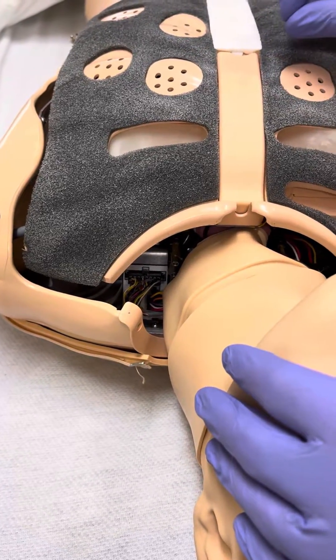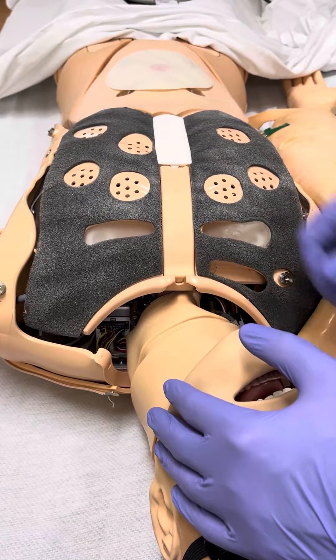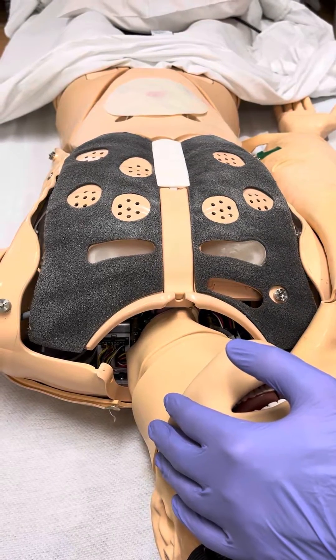Make sure you're oscillating the areas that are not working and then double check at the very end for those to start working. As you're doing chest compressions, the wire loom gets moved around and the wires sometimes can lose contact.